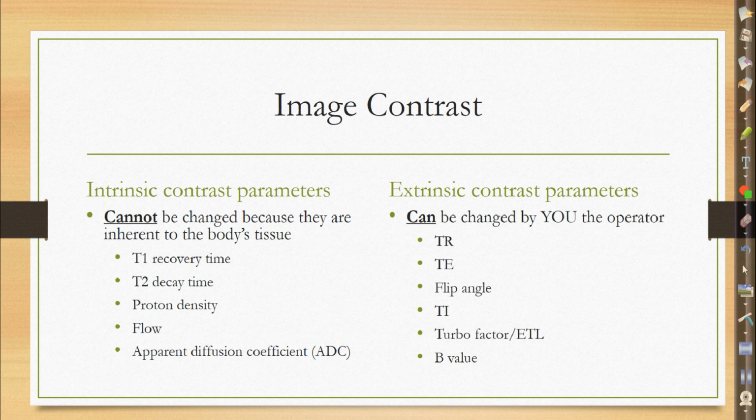That could be something that you select, either the middle cell or the outside cells. Is there anything else? What's that? The procedure. Which one you're doing? Procedure? Yeah. So all those things are things that we can manipulate. Those are going to be in the category for MRI over here called your extrinsic parameters. These are things that we can change.